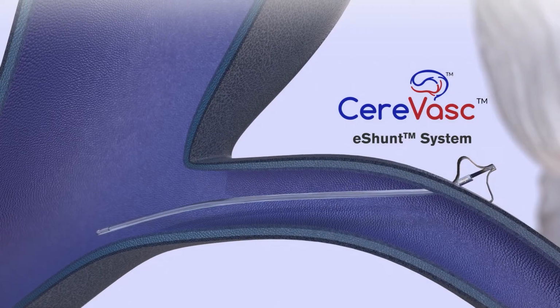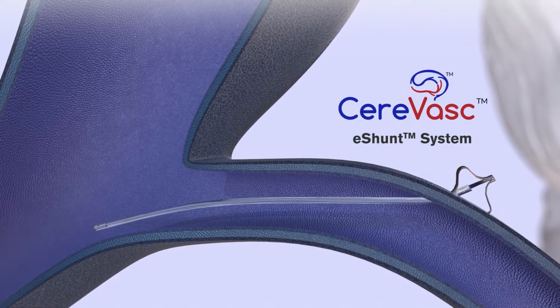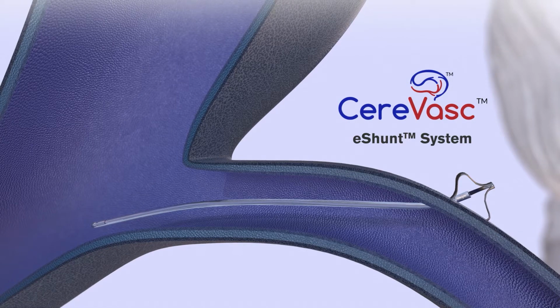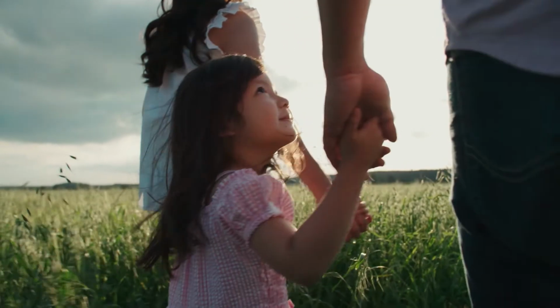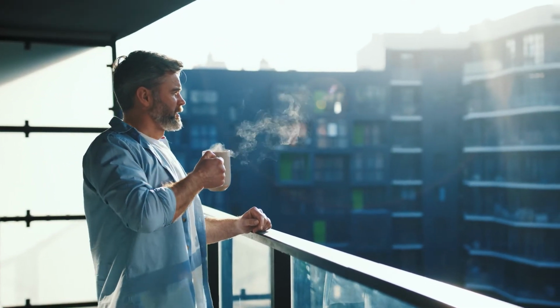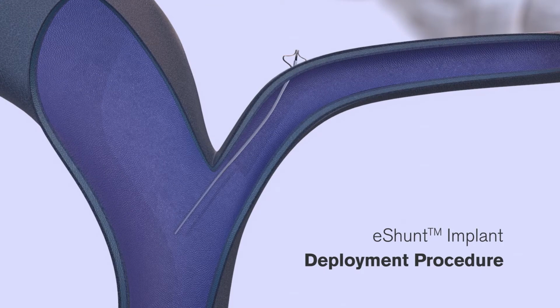The e-shunt system consists of endovascular delivery componentry and a permanent implant intended for the treatment of communicating hydrocephalus to shunt cerebrospinal fluid from the intracranial subarachnoid space to the venous system. The e-shunt system has the potential to significantly improve patient outcomes and substantially decrease the overall cost of surgical treatment of this life-threatening condition. We will now examine each step in the implant deployment process.